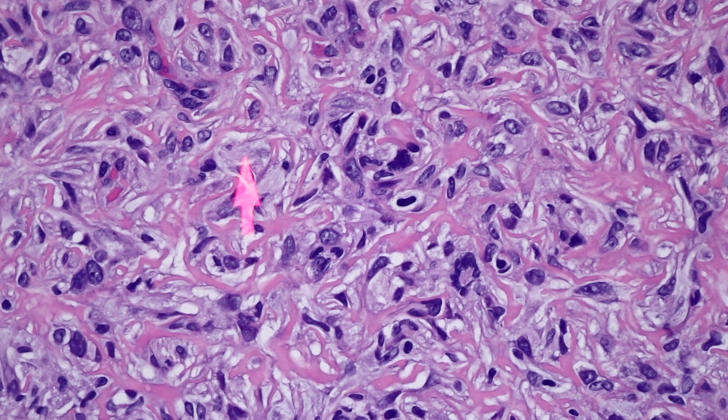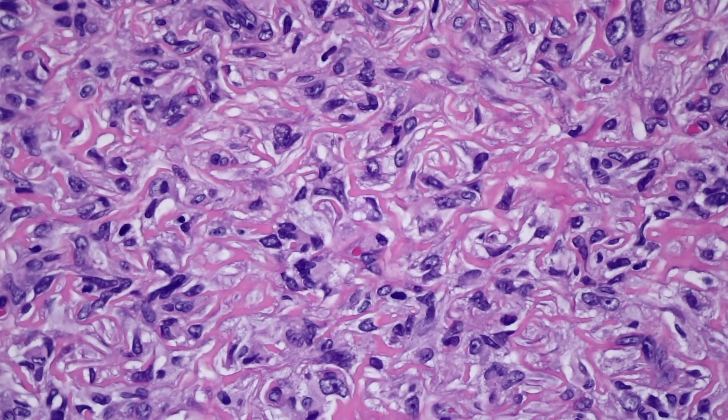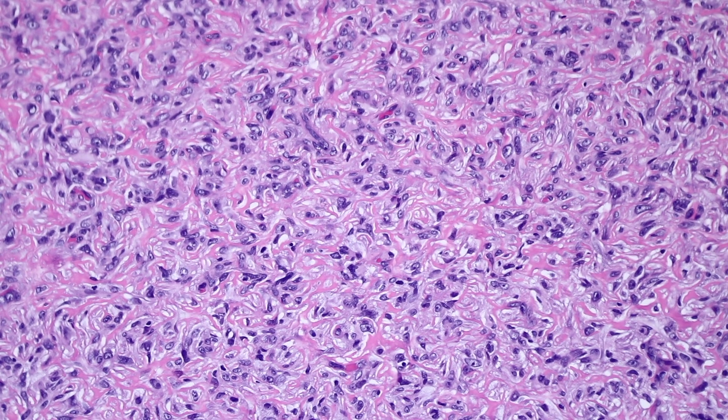Notice the abundant cytoplasm that's very pale - a lot of the cells have foamy cytoplasm. This is what we call the lipidized subtype of Dermatofibroma, and they tend to occur at the ankle or the lower leg, which is where this lesion was from - also known as ankle-type Dermatofibroma. Ankle-type or lipidized Dermatofibromas have these rings and arches of real dense pink collagen and a lot of foamy cytoplasm. It can be so abundant that some areas look very similar to xanthoma.